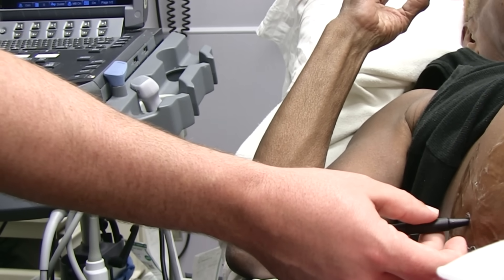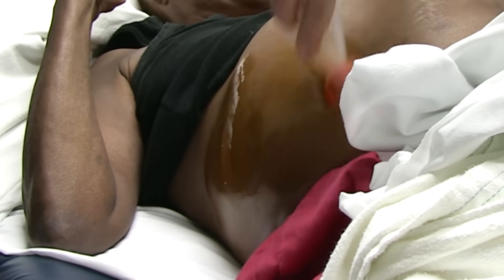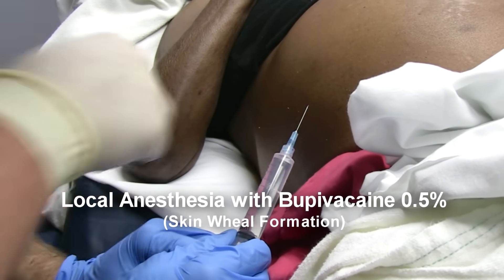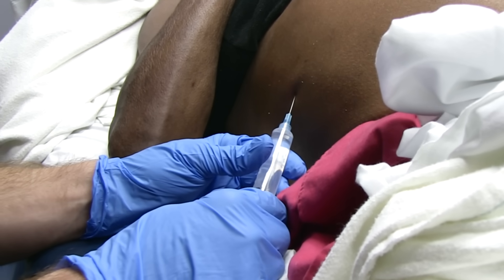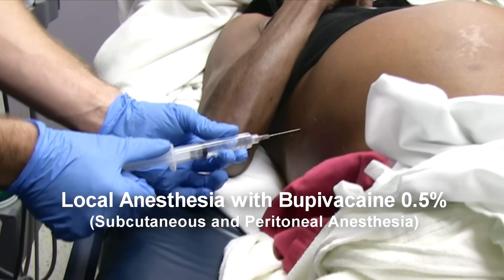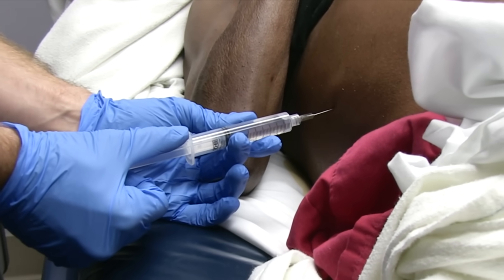That works really well. We're going to give you local anesthetic first, then get you all clean. Skin wheal first — this is where people just go straight in and aspirate until you get peritoneal fluid, until you get ascites. Go a little bit larger and keep aspirating until you aspirate fluid.